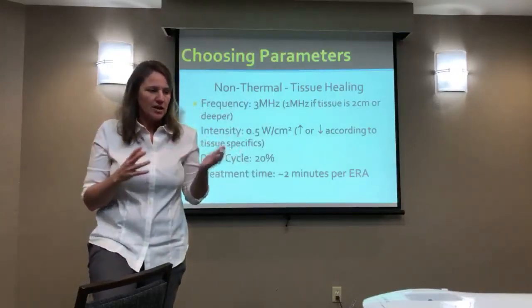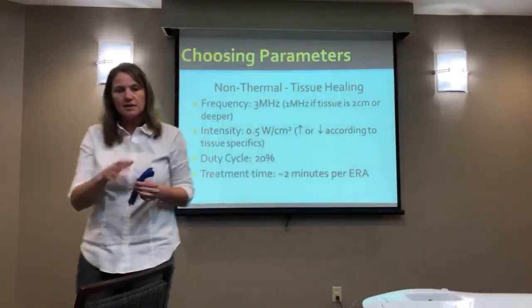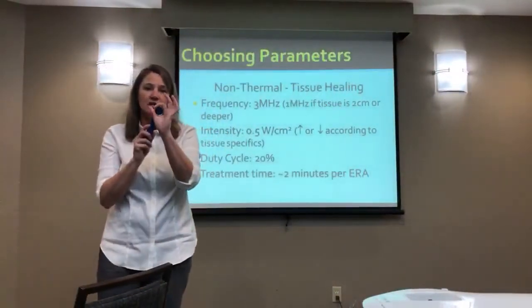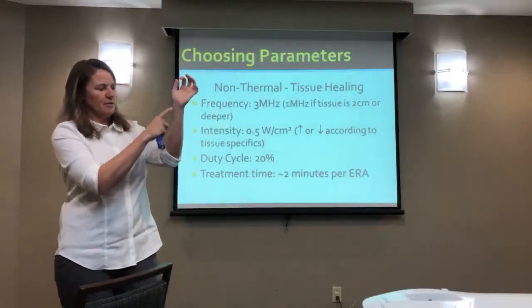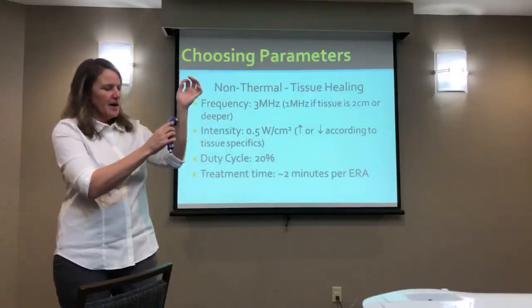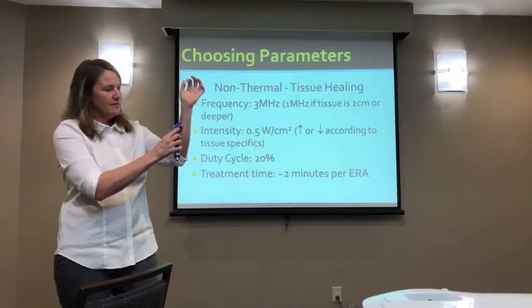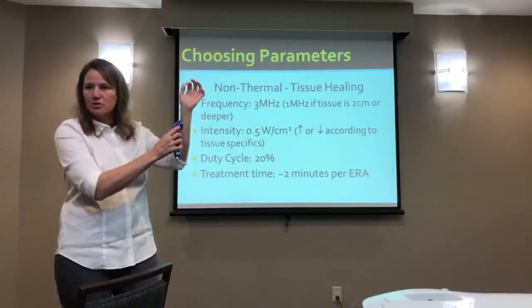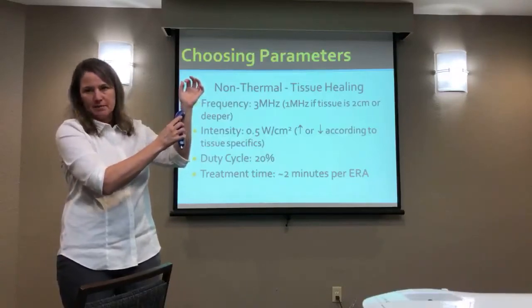And the way I look at it is, when we talk about heat, we'll have a different type of recommendation. So what was recommended is 2 minutes per area the size of your sound head. So let's say my target was from here to here, and I was gonna target this area. I would do 2 minutes, approximately twice the size of my sound head, the same rate, at 3 to 4 centimeters per second, and then I would go to an overlapping segment, do 2 minutes there. And then an overlapping segment for 2 minutes there.